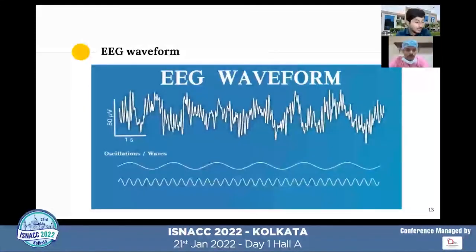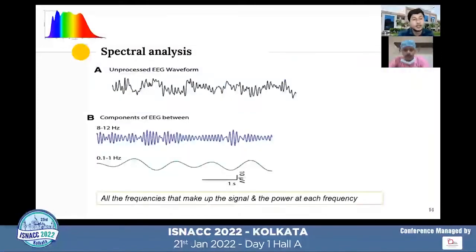When you see an EEG waveform, it looks complicated, because actually an EEG waveform is formed by multiple waveforms superimposed on each other. If you analyze this EEG, we can see multiple waveforms in it. Here we can see one sine waveform going like this. Along with that, you can see another waveform of higher frequency. This is how an EEG waveform is formed. So analyzing the raw EEG looks very difficult.